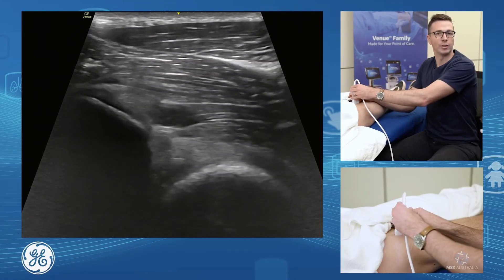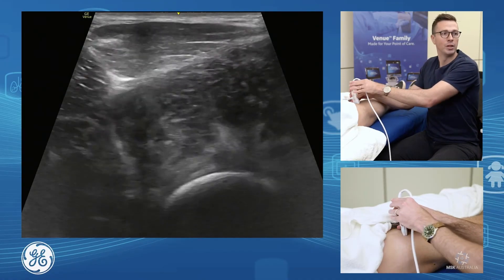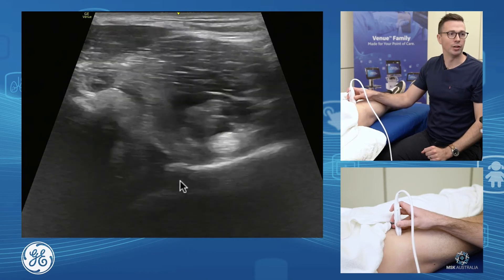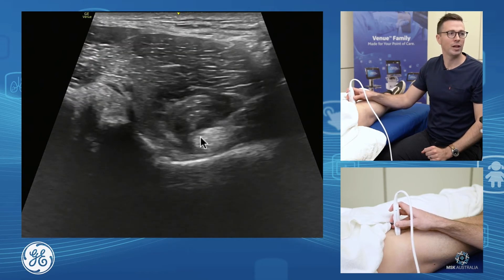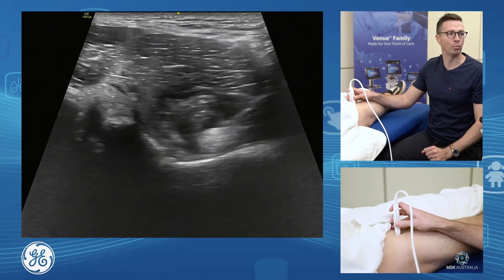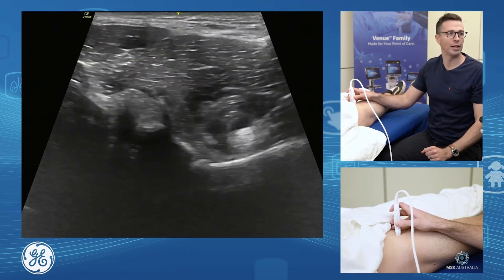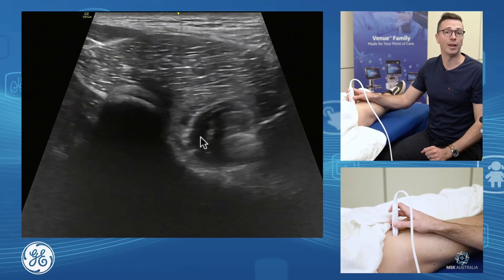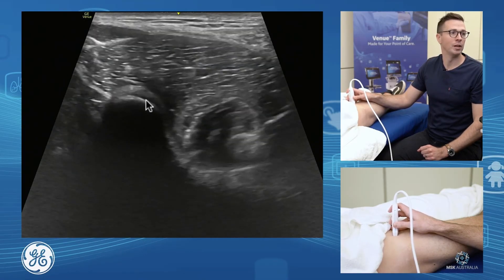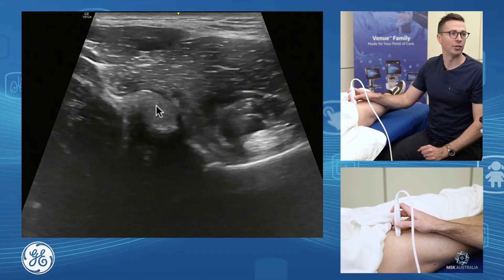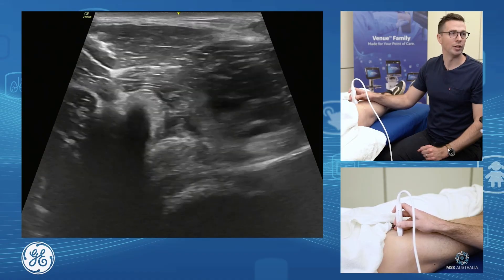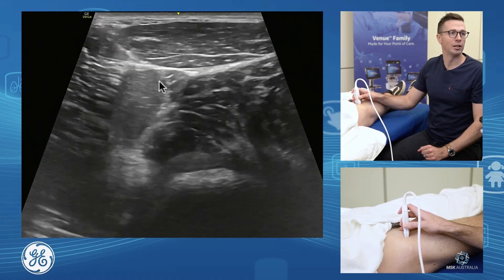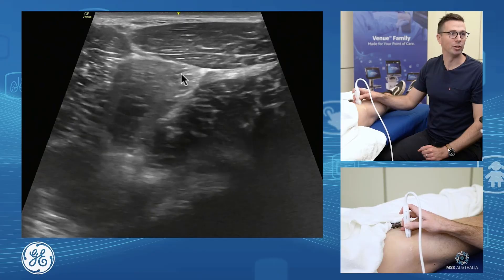The other way of getting to rectus femoris is from the anterior hip joint. We find our iliopsoas and just bring our probe lateral and a little bit superior to identify the anterior inferior iliac spine. There's our AIIS and the rectus femoris coming off with our reflected head, giving its contribution to the muscle.